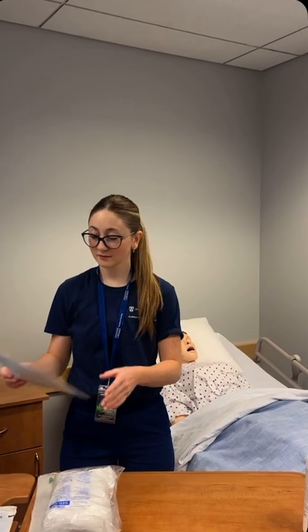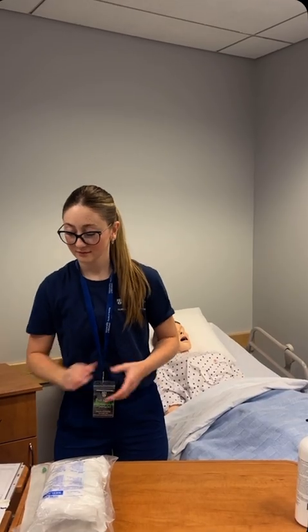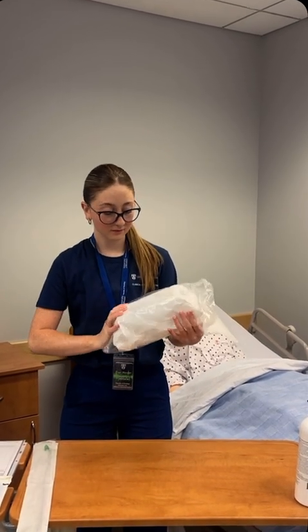Checks provider order regarding catheterization prescription. Gathers supplies and checks integrity of packaging.